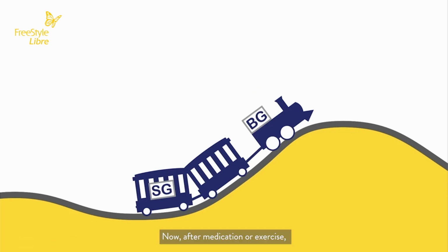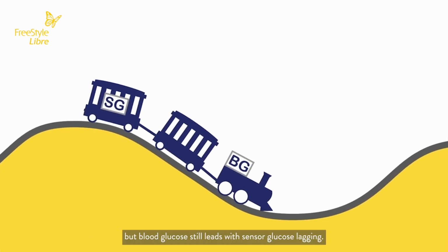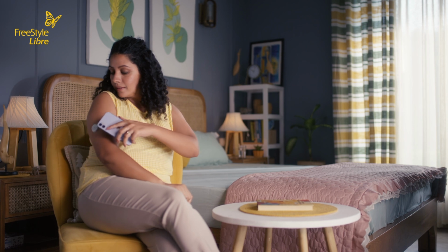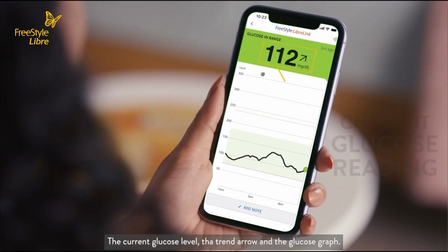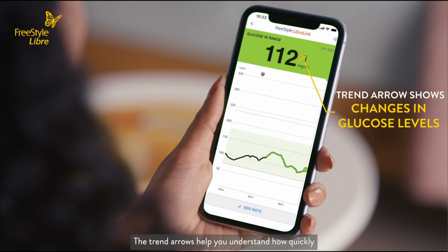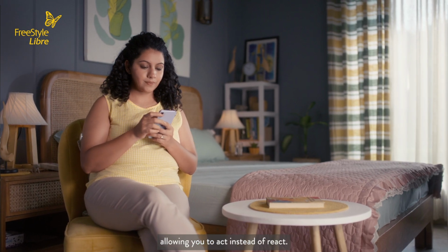Now, after medication or exercise, the train may start to head down the hill, but blood glucose still leads, with sensor glucose lagging. When you scan using the FreeStyle Libre, you get 3 different types of data: the current glucose level, the trend arrow, and the glucose graph. The trend arrows help you understand how quickly your glucose levels are changing, allowing you to act instead of react.